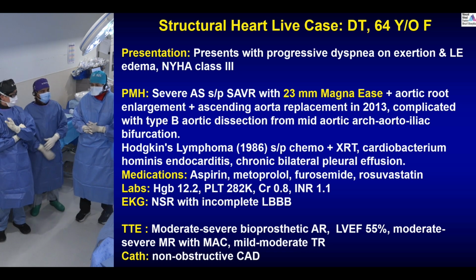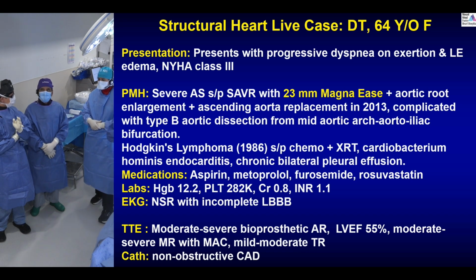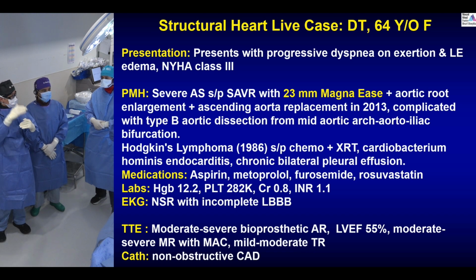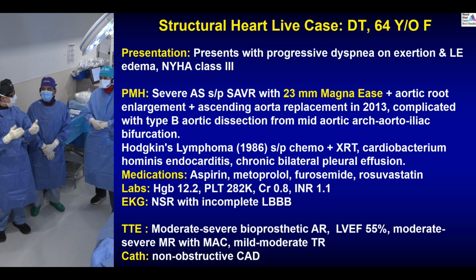But more importantly, aortic root enlargement is a relative contraindication to balloon valve fracture. I think people do not understand, especially with replacement, you do not have a continuity between the aorta and the ventricle anymore. So if you use a high pressure balloon fracture, you can actually rupture the annulus, and that's been reported. So in this case, the patient incidentally was actually presented with MAC, severe MR as the primary presentation.